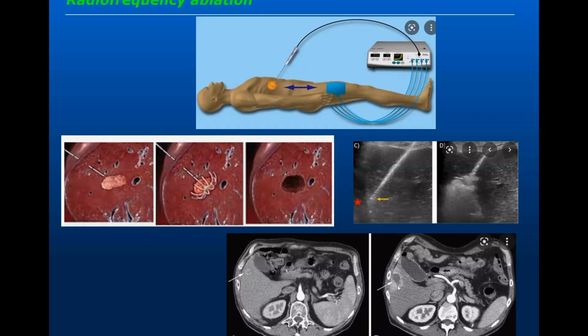We killed the tumor. You will see some halo of uptake. This is the tissue, what we call hyperemia. This is the area that was touched by the heating but was not killed. It's something that's very expected. And that's why I always mention that we ablate a bigger area than what we see on imaging, just to make sure we have a good margin. So this is for radiofrequency ablation.